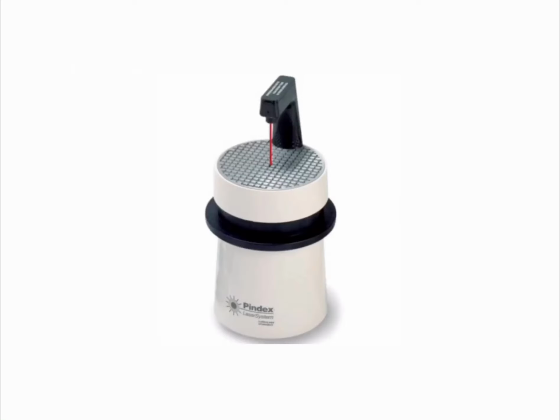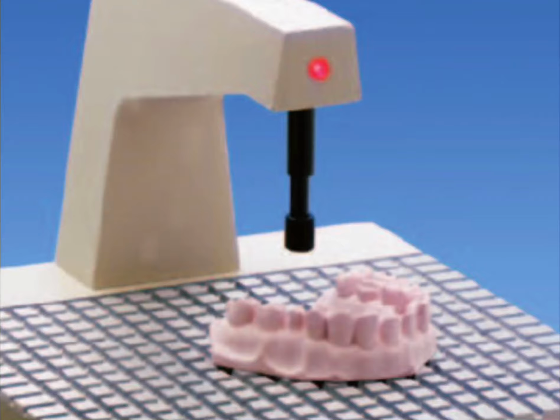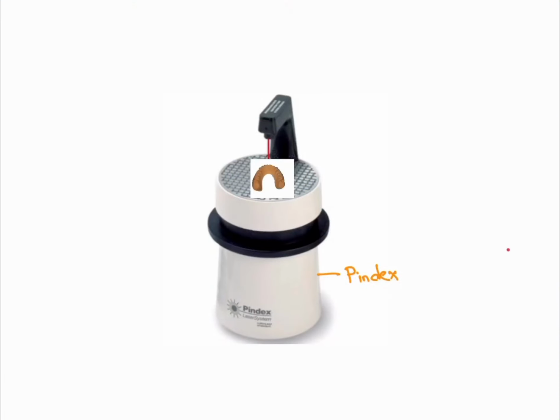For making the hole, we will use the Pindex system. We will keep our cast in this region. Laser beam coming from the system will help to locate the point. From below region there comes a pin which marks the point.